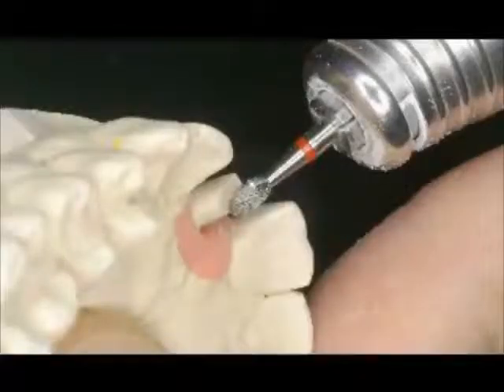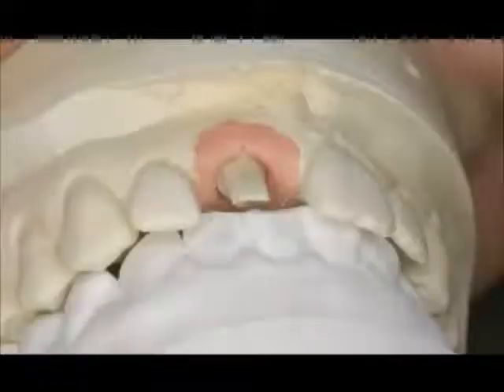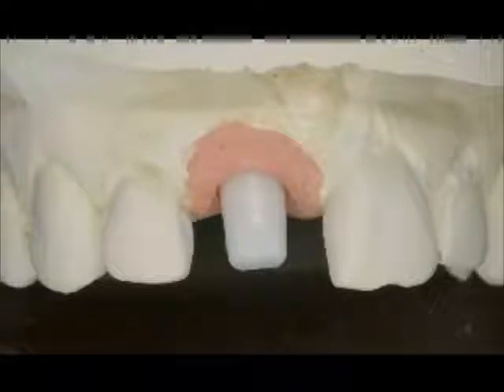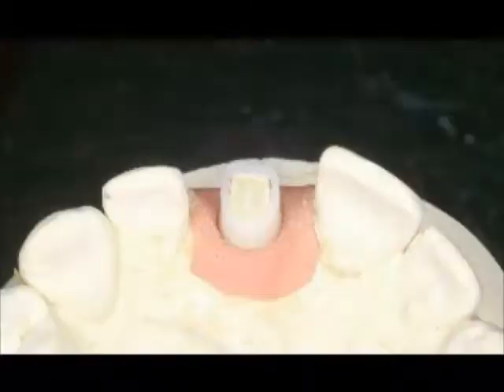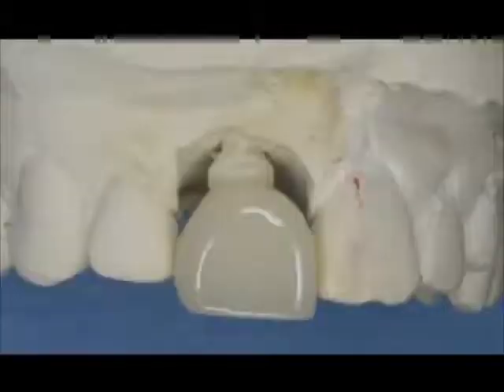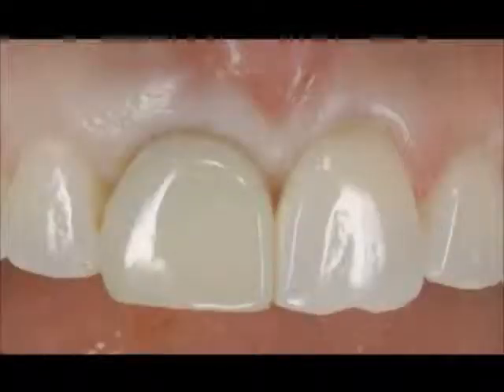One of the things that we have to do with these abutments at times in the lab is form a reduction coping to make sure we have adequate incisal clearance for the final ceramic material. Here we're seeing a reduction gauge of approximately 1 millimeter. And we now utilize the temp base cap to be used as a reduction coping intraoperatively. And this is what the restorative dentist would have to do in the mouth. We place this in the mouth the same day. This is the temporary after the reduction coping has been utilized.